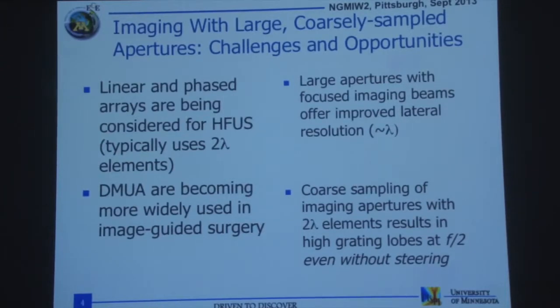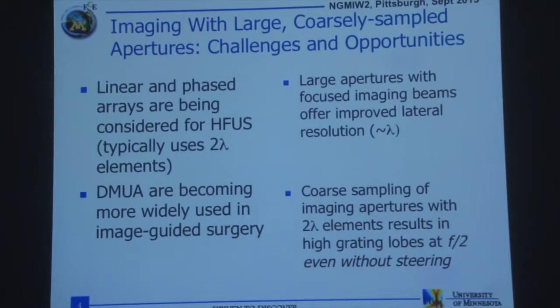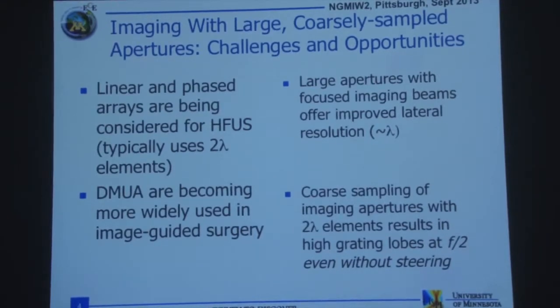The motivation for some of this work is that, since I started looking at ultrasound many years ago, I thought that coded excitation was key to both imaging and therapy. One easy thing for me to visualize was that if I have a less than ideally sampled array, with coded excitation you can actually remove some of these artifacts. Some of this was more focused on diagnostic imaging.